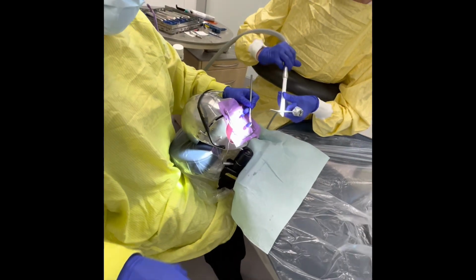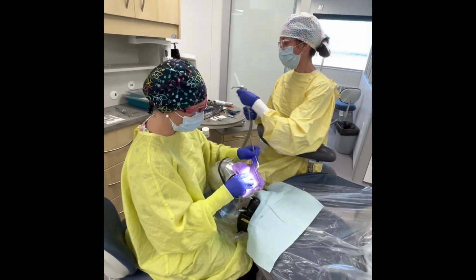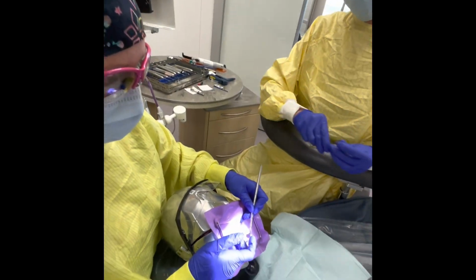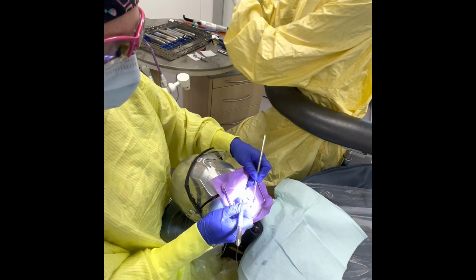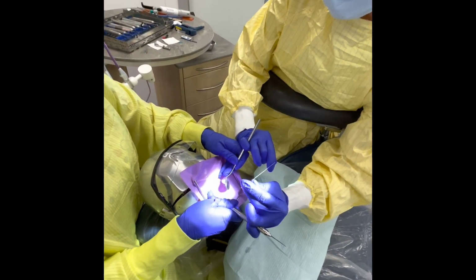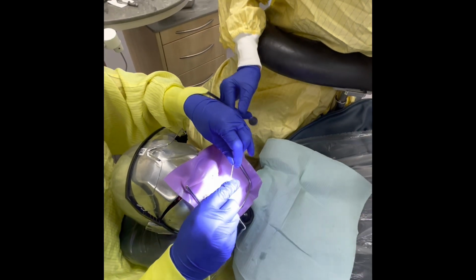So the next thing I'm going to do is request an explorer to check the lingual of that. Make sure it's nice and smooth. Thanks, Stacy. Oh, that's beautifully smooth. The next thing that we're going to do is check the interproximal, please. So we're going to do a two-handed transfer. Stacy's going to take the mirror and explorer and flip me the floss. Okay.